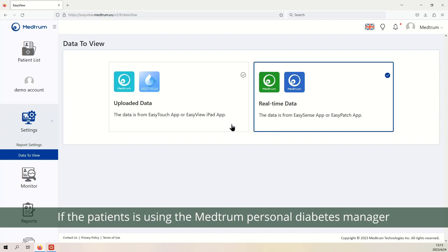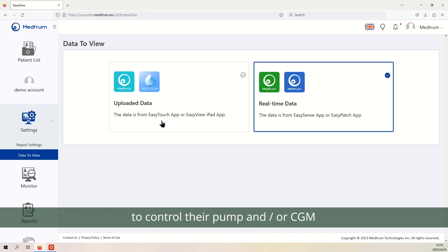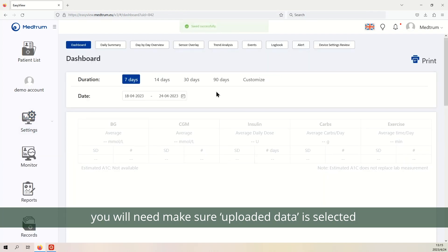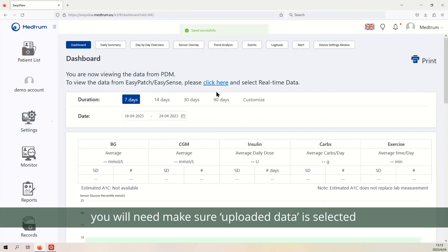If the patient is using the Medrum Personal Diabetes Manager to control their pump and or CGM, you will need to make sure uploaded data is selected.